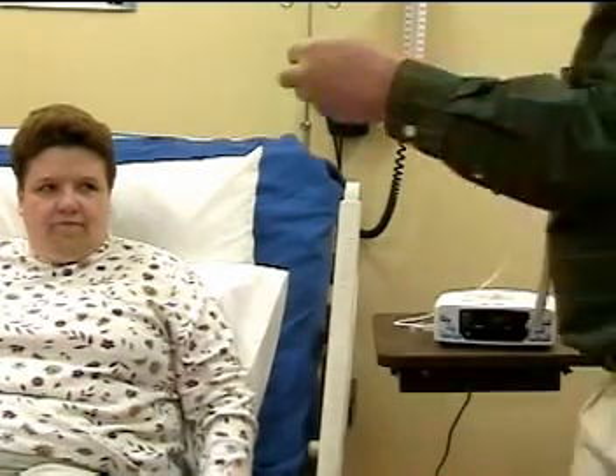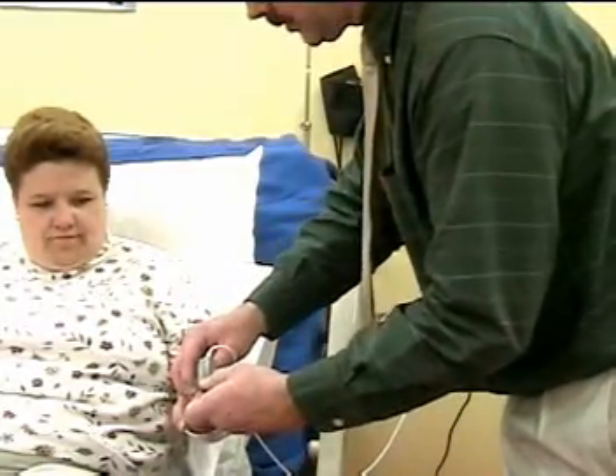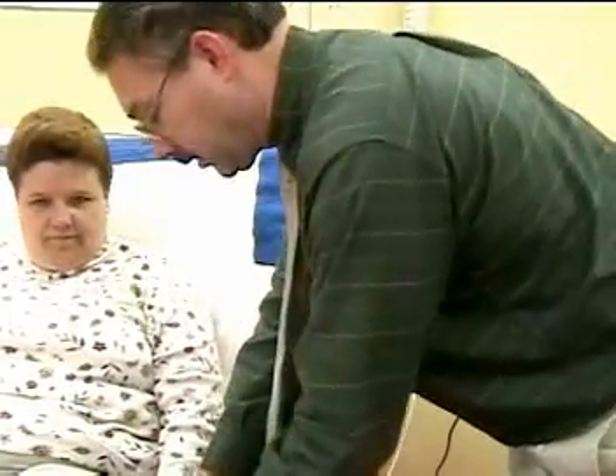Then you're going to apply it typically to the finger, but you can also use it on a toe, an ear, or a foot as in an infant. Ms. Brown, I'm going to connect this to your finger. Make sure that you get the right side up. Attach it to the finger and have the patient keep their hand downward.